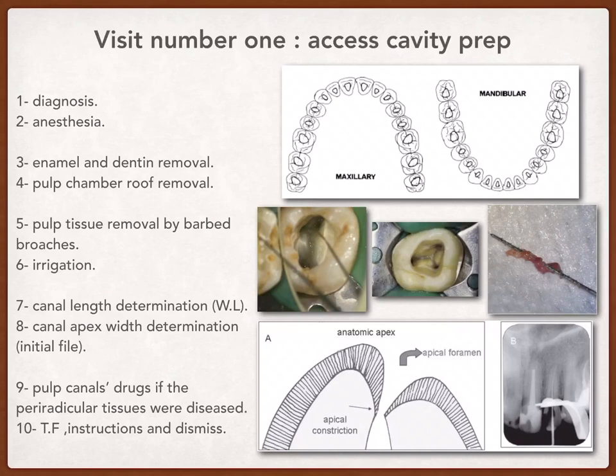That was the removal of the enamel and dentin outline form.